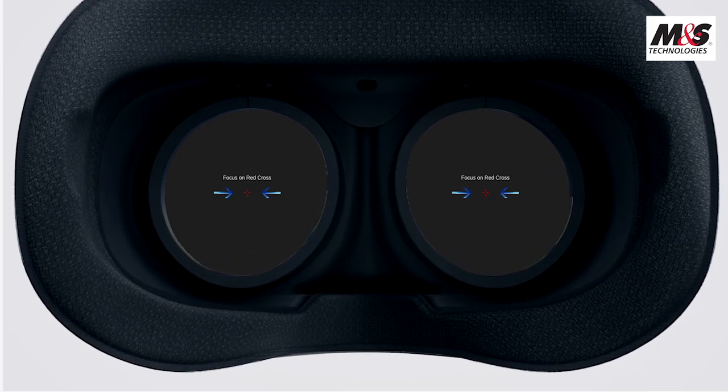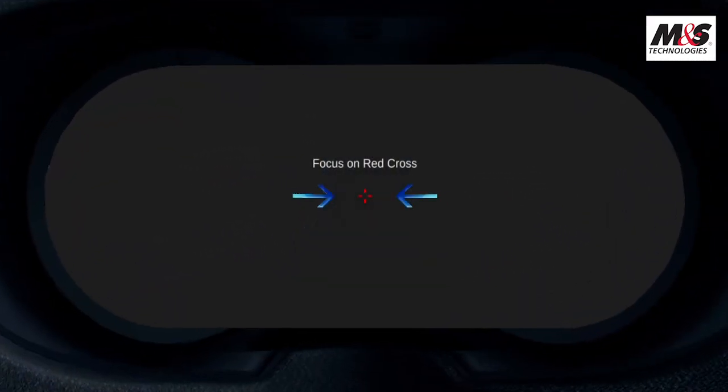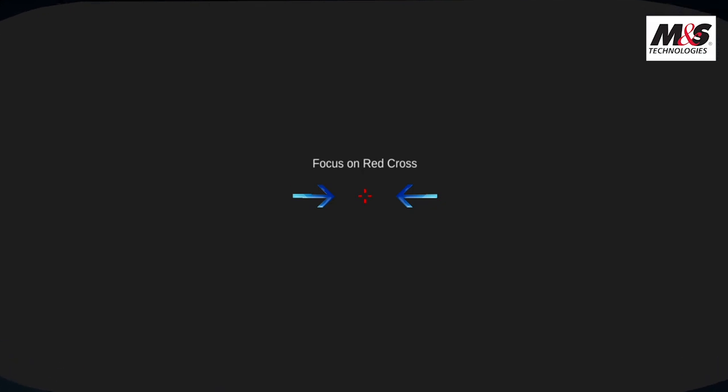There will be audible instructions from the headset speakers to guide you through the test. You'll see two blue arrows pointing to a red cross in the middle of the screen. During the entire test, we want you to stay focused on the red cross. As you keep your eyes focused on the red cross, gray dots will appear one at a time.